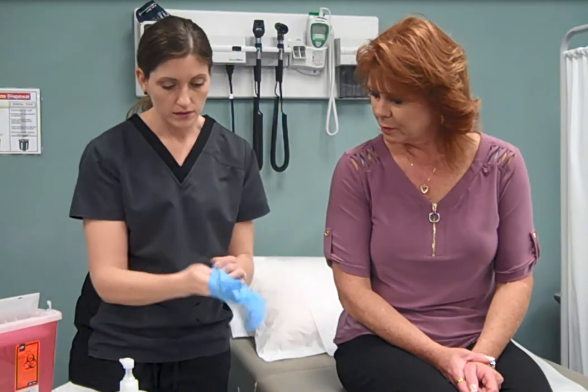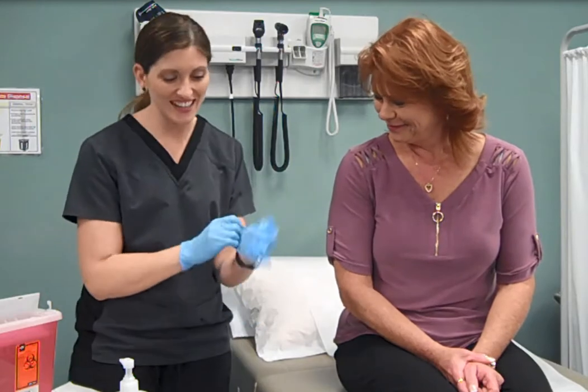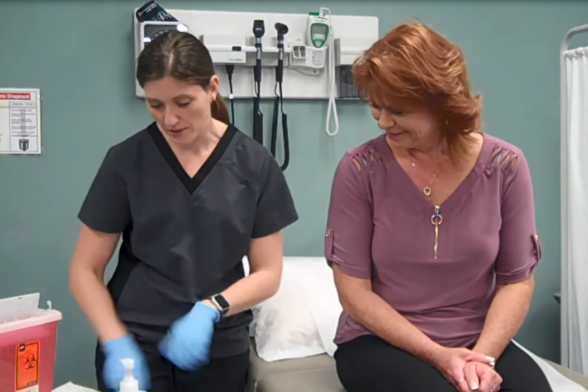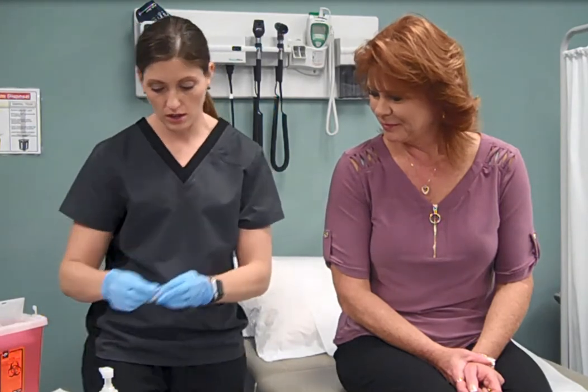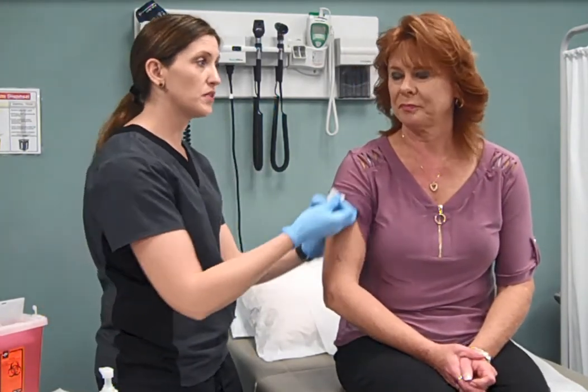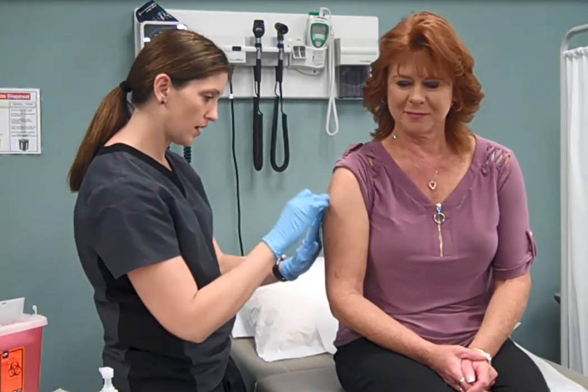After hands are washed, make sure you apply gloves. Select and prepare the injection site with an alcohol prep pad. Allow the alcohol to air dry.